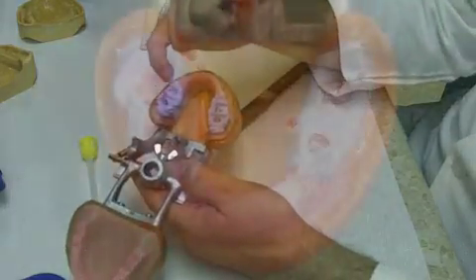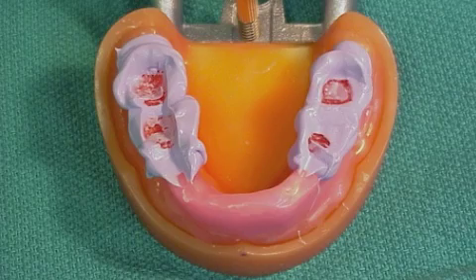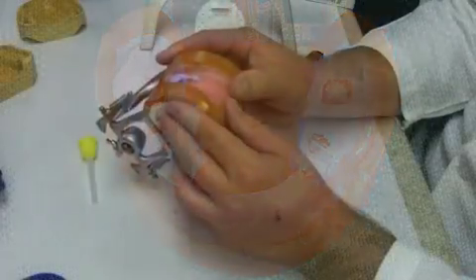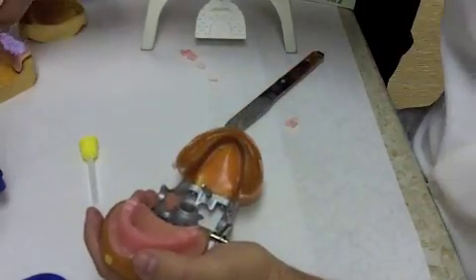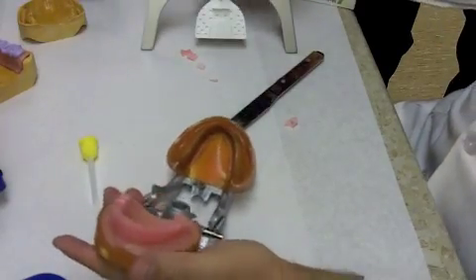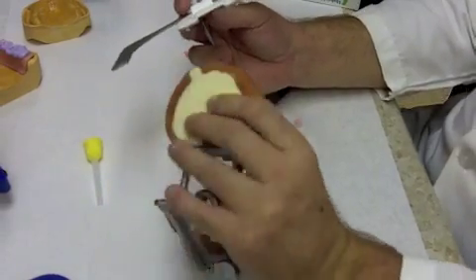Then you want to open and you want to evaluate, and you want to be able to see those red wax cones sticking through. That just tells you, it's another visual to show you that you have everything seated all the way. So now you can use that mandibular registration and rim to mount your maxillary cast. Then we want to bring in the facebow.